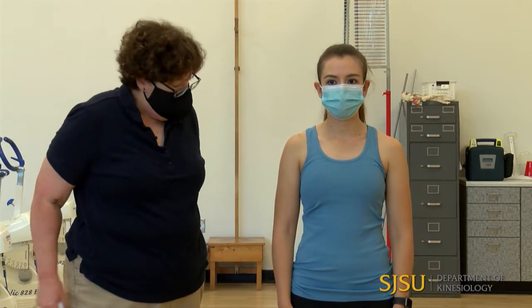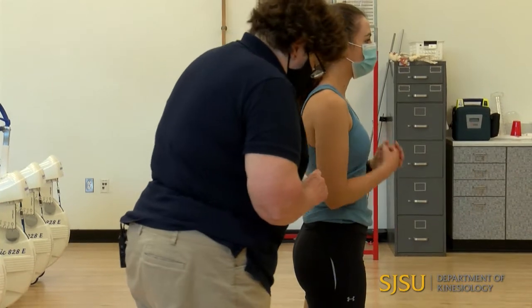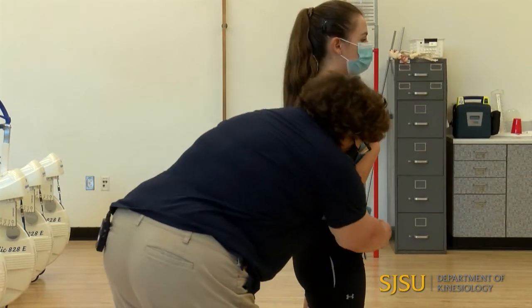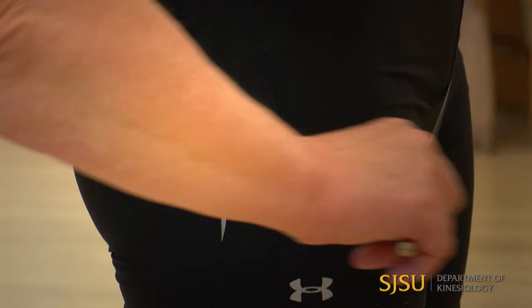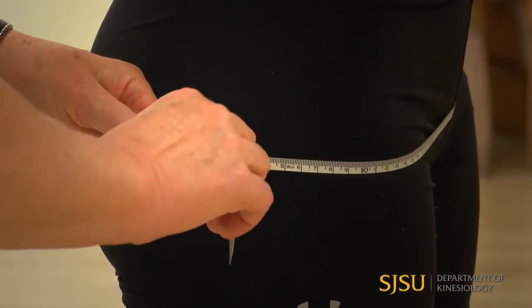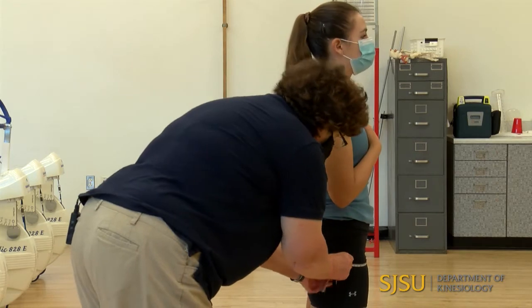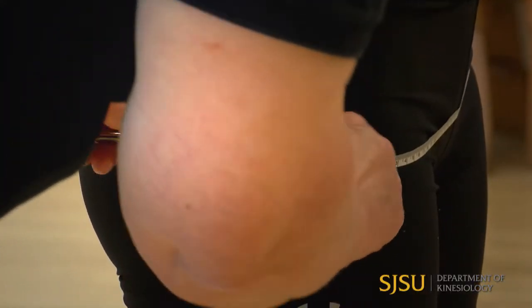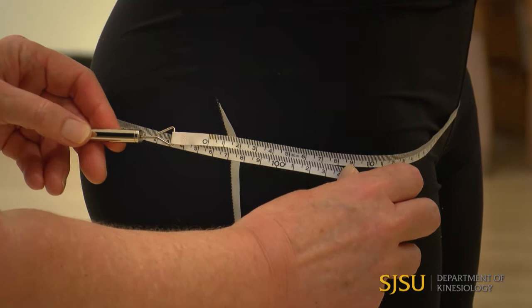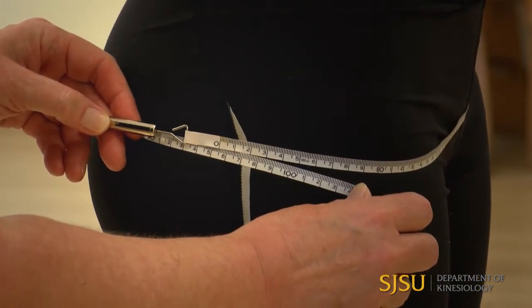Now we're going to measure the hips and buttocks. You need the widest protuberance posteriorly over the gluteal muscle — the widest point — which you can identify from the side. Wrap the tape measure around right over the widest portion. If it's slipping on the clothing, you need light fitting clothing for this; you can have the client put her hand on the tape to hold it. Double check it's level, pull it out to the mark on the Gulick handle. That measurement is 95.5 centimeters.